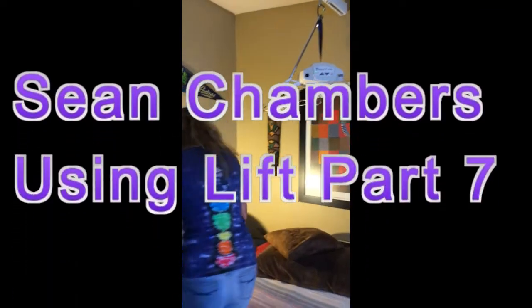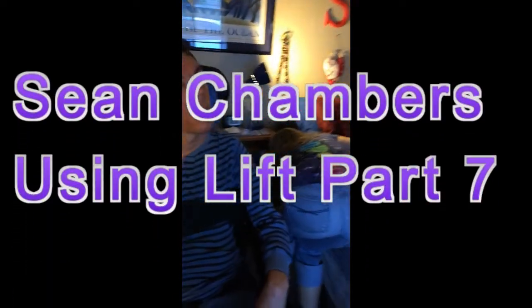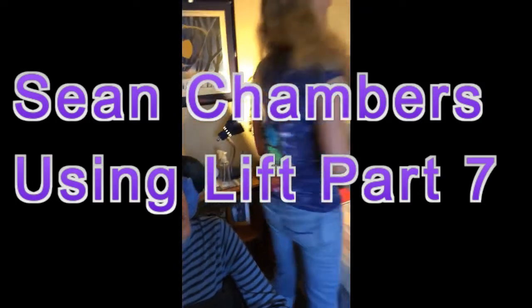So when you're done charging, make sure you tuck this under the bed, really far out of the way, so it's not going to get tangled up in somebody's feet.